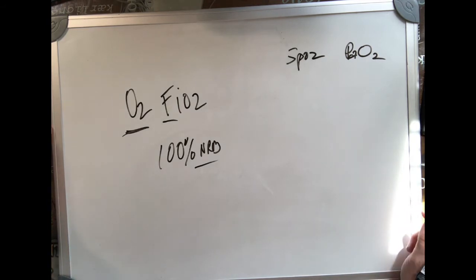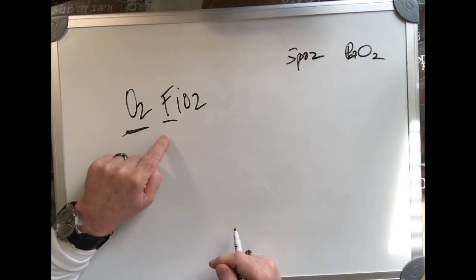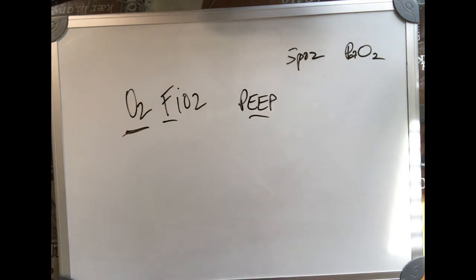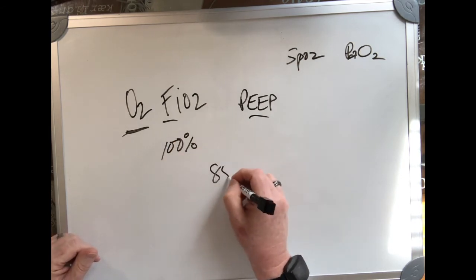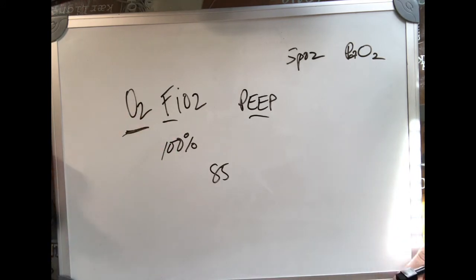So we said earlier that there's only 2 ways that I can really do this. One way is with the FiO2, and the other way is by adding PEEP. Well, PEEP is real easy to add. It's not that difficult. But let's just say I've got you on a non-rebreather at 100%, and your SAT is still 85. Okay, your SpO2 is 85. Is this cutting it? The FiO2 is not enough. So what do I have to do?